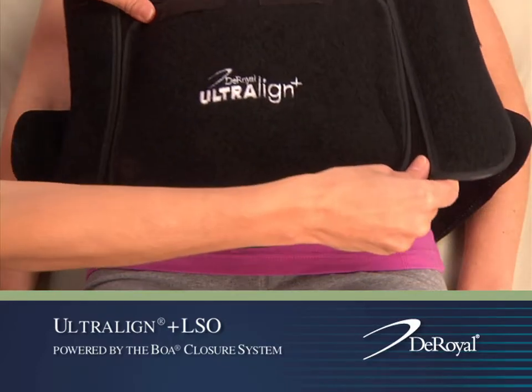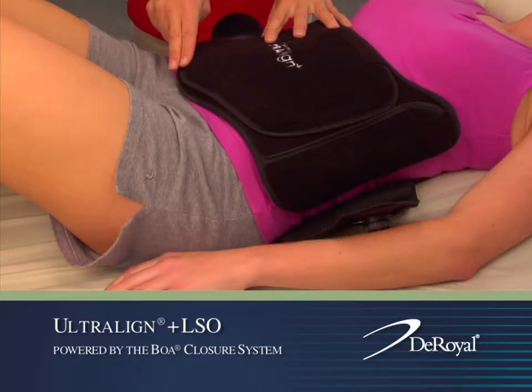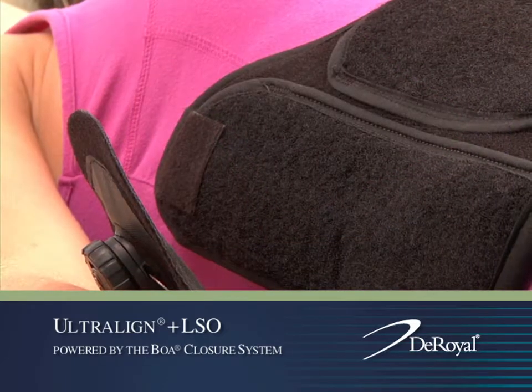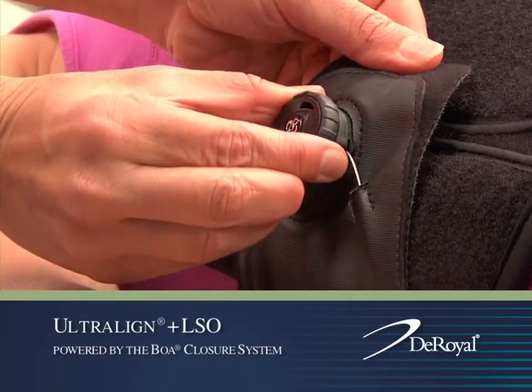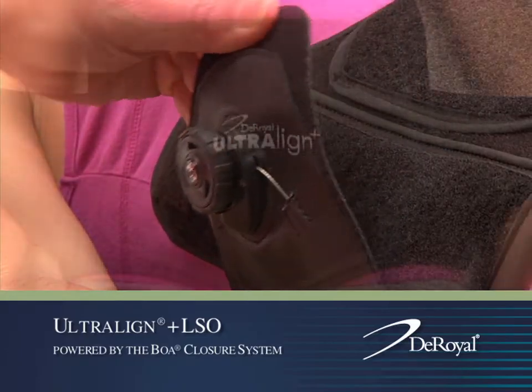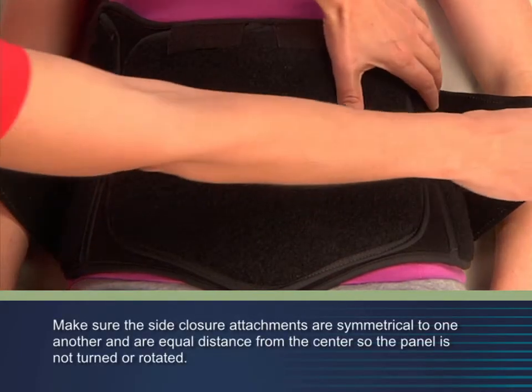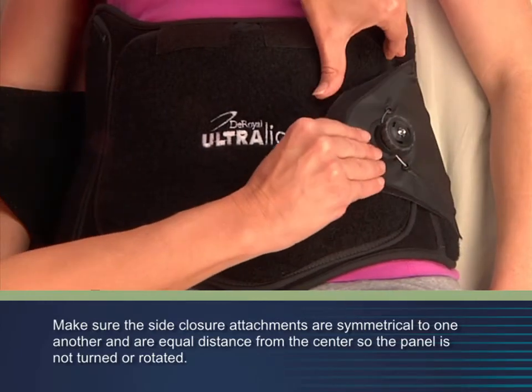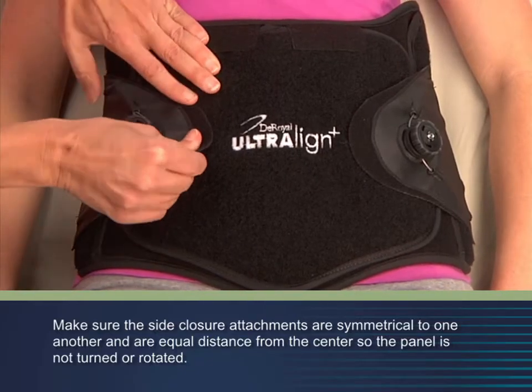Place the anterior or front panel in the proper position, one inch above the pubic bone. Ensure the dial on each side of the orthosis is disengaged by pulling out on the dial. Secure the side closure attachments by applying them to the anterior front panel — first on the left side, then on the right.